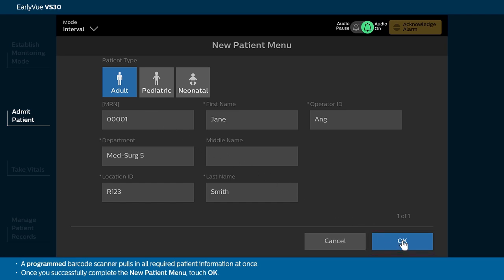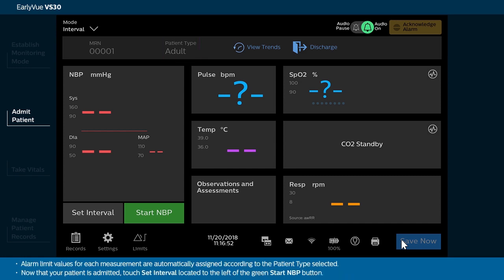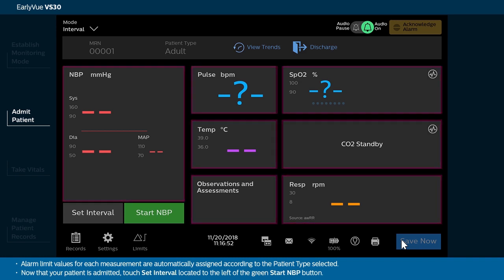A programmed barcode scanner pulls in all required patient information at once. Once you successfully complete the New Patient menu, touch OK. You are returned to the main screen. The patient bar now displays the admitted patient with primary ID shown as MRN00001 and patient type as adult. Alarm limit values for each measurement are automatically assigned according to the patient type selected.